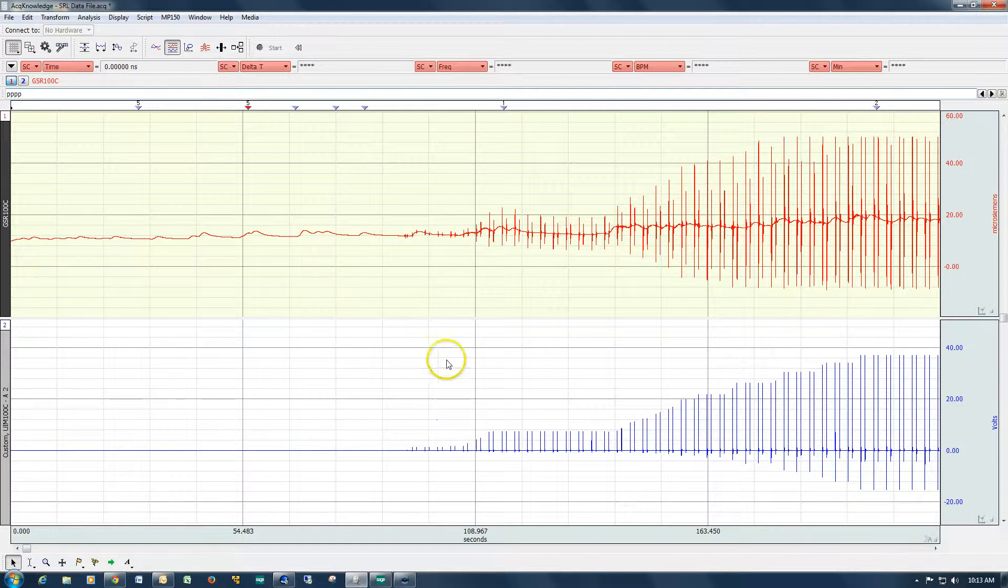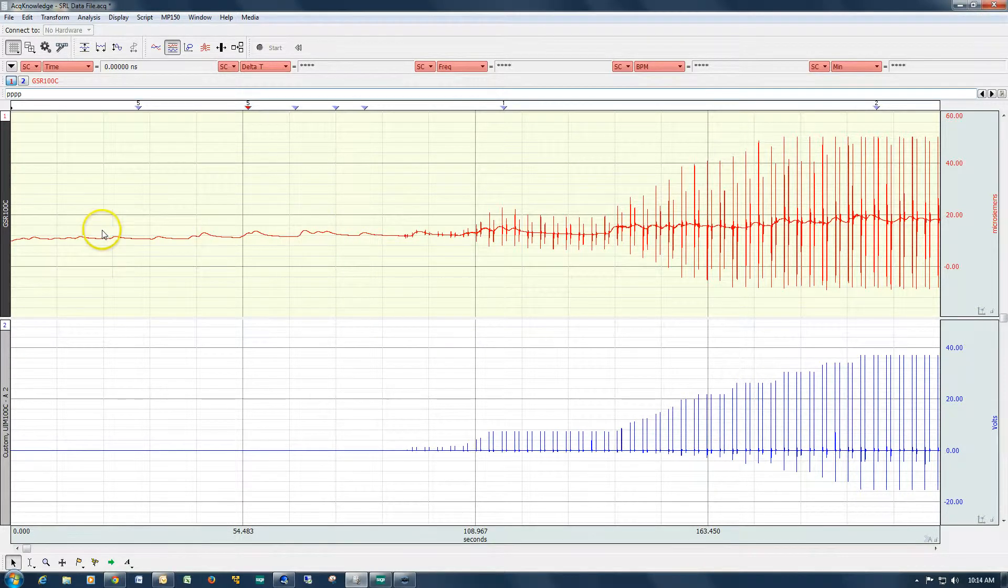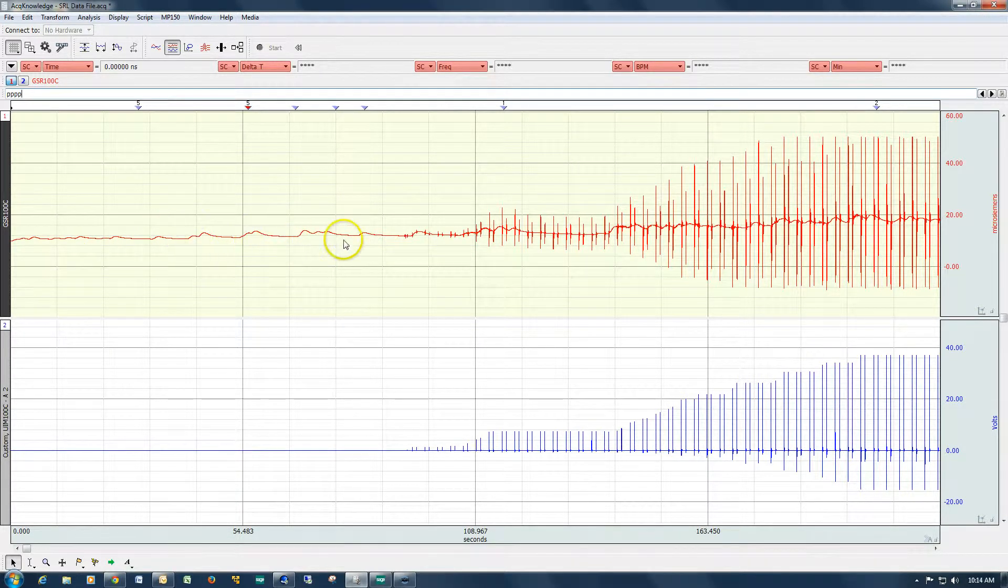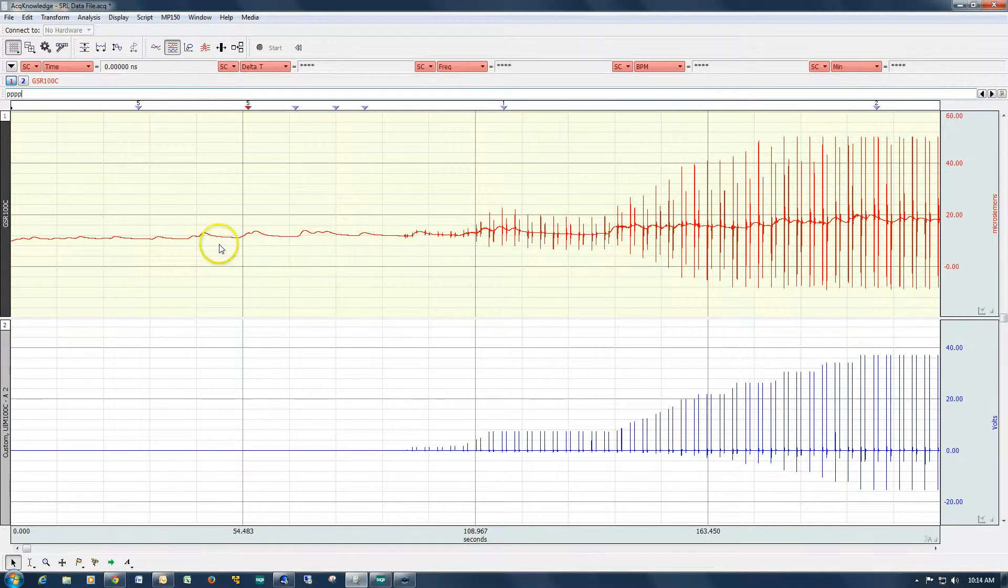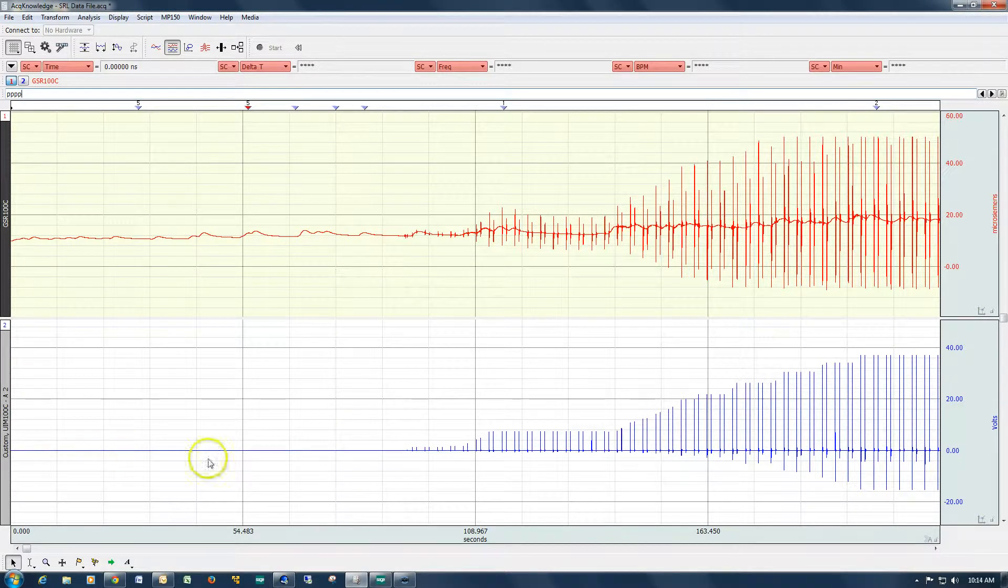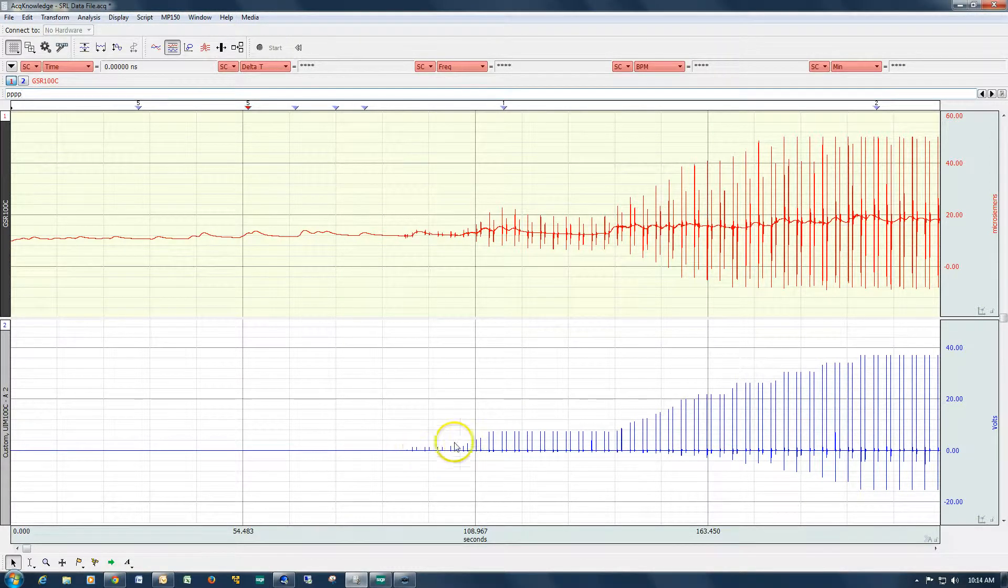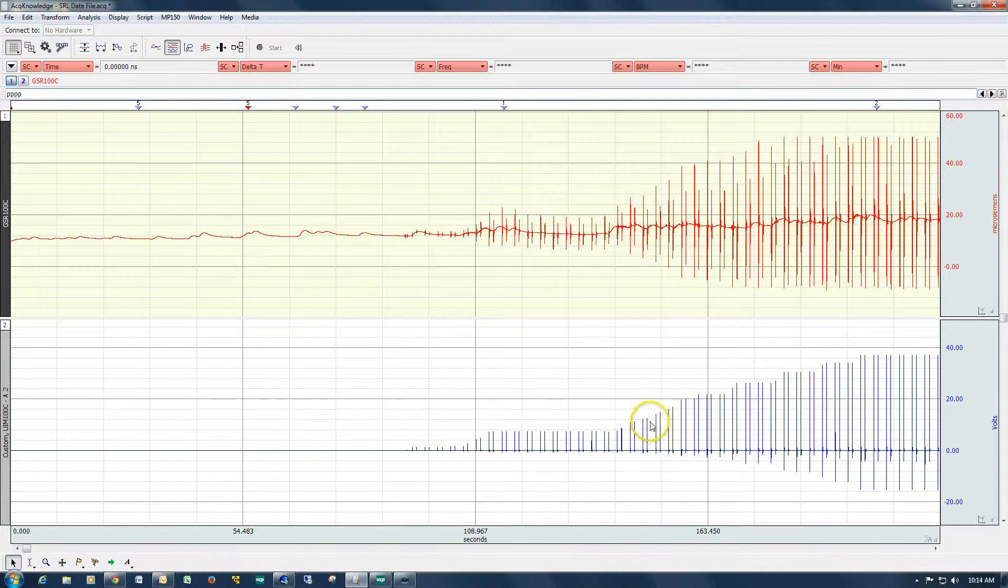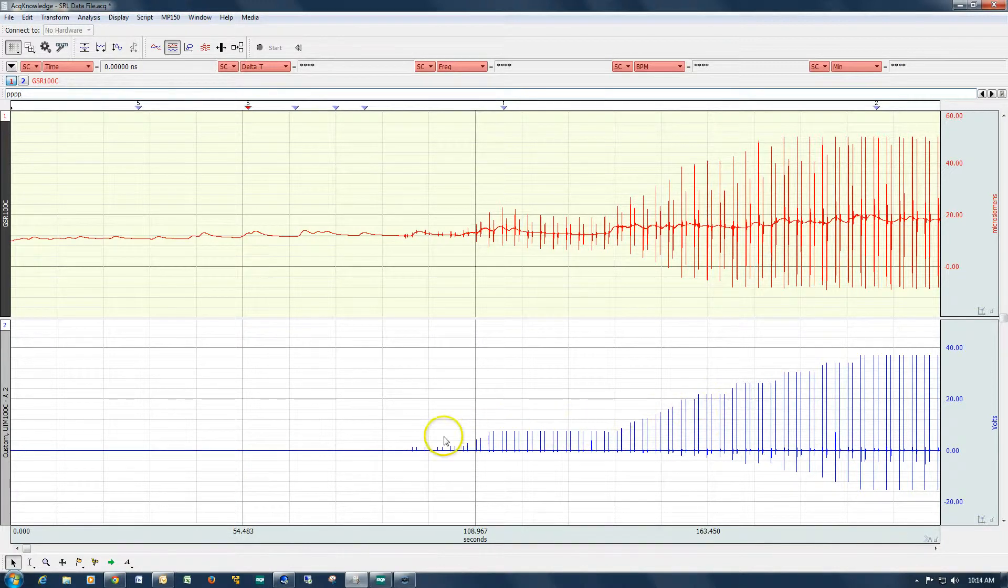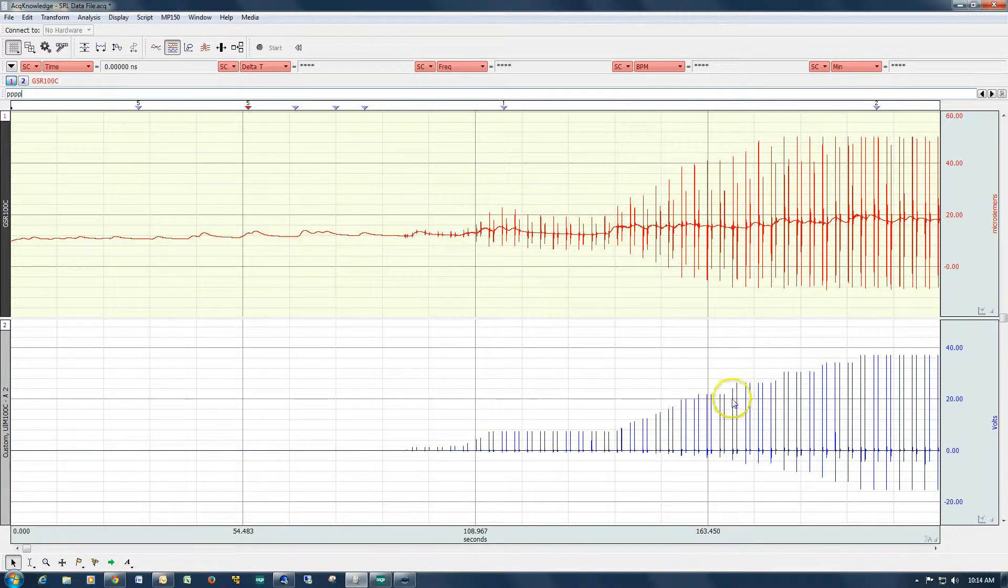I've got a file here which we will use for this particular demonstration. The top channel, the red one that we're looking at, is electrodermal activity and this is skin conductance level. The bottom channel is the output from the stimulator and this is pairs of electrical stimuli that were presented to a subject. And over time you can see the amplitude was increased.